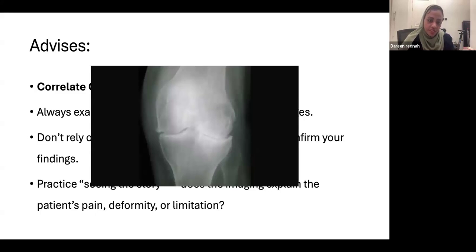This X-ray, when we see it, shows severe osteoarthritis of the knee. The patient needs total knee replacement. But when we saw the patient, she is thin, a non-smoker, active, going to the gym, swimming, squatting without pain, sitting on the ground, praying on the ground. She does not need a total knee replacement because her muscles are strong enough to offload the joints.